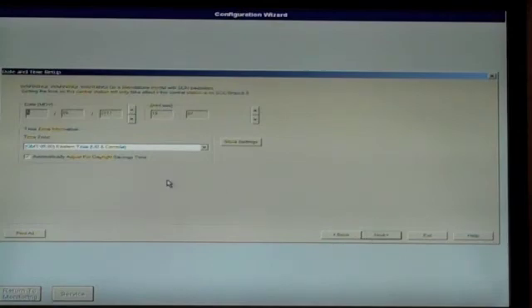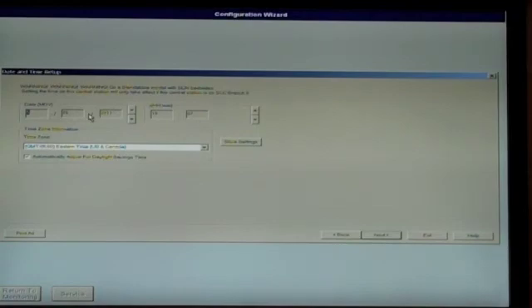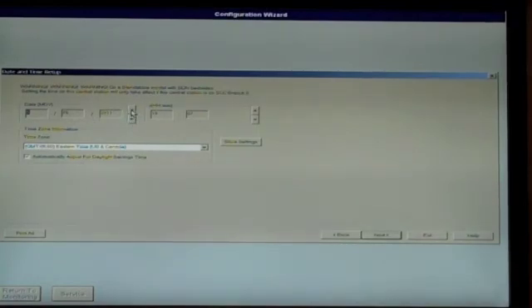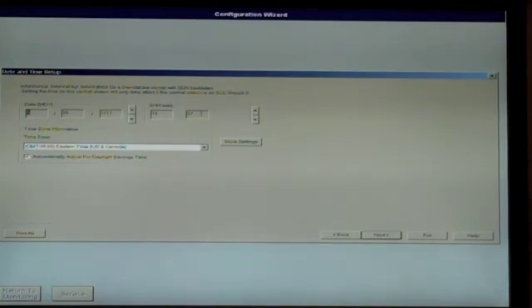At the date and time setup screen, verify the correct settings for your locality. If they are incorrect, highlight each incorrect field and use the up or down arrows to adjust them. Once all fields are correct, click Next.